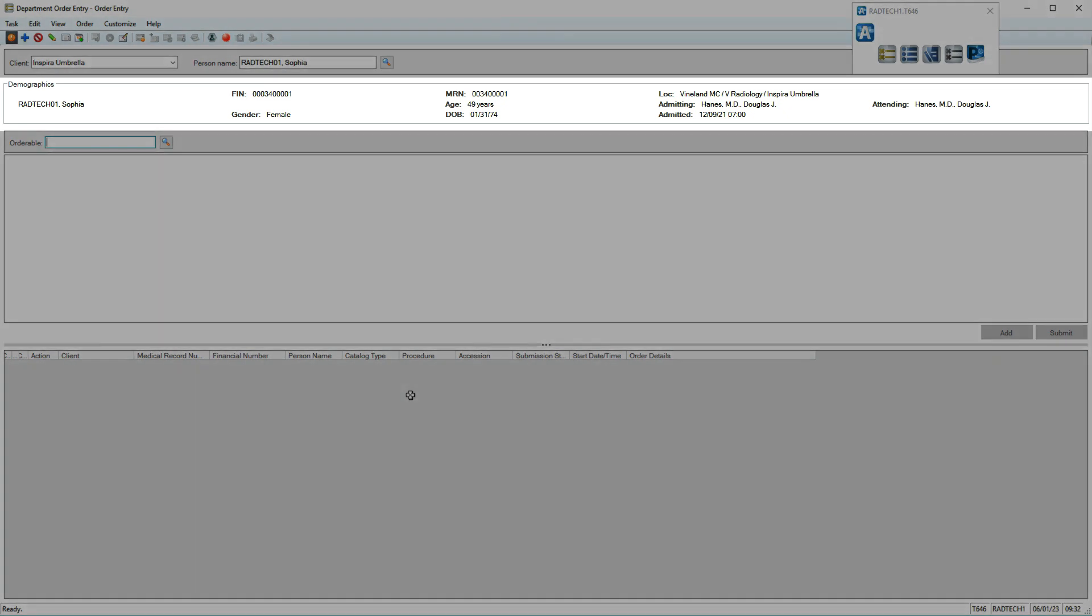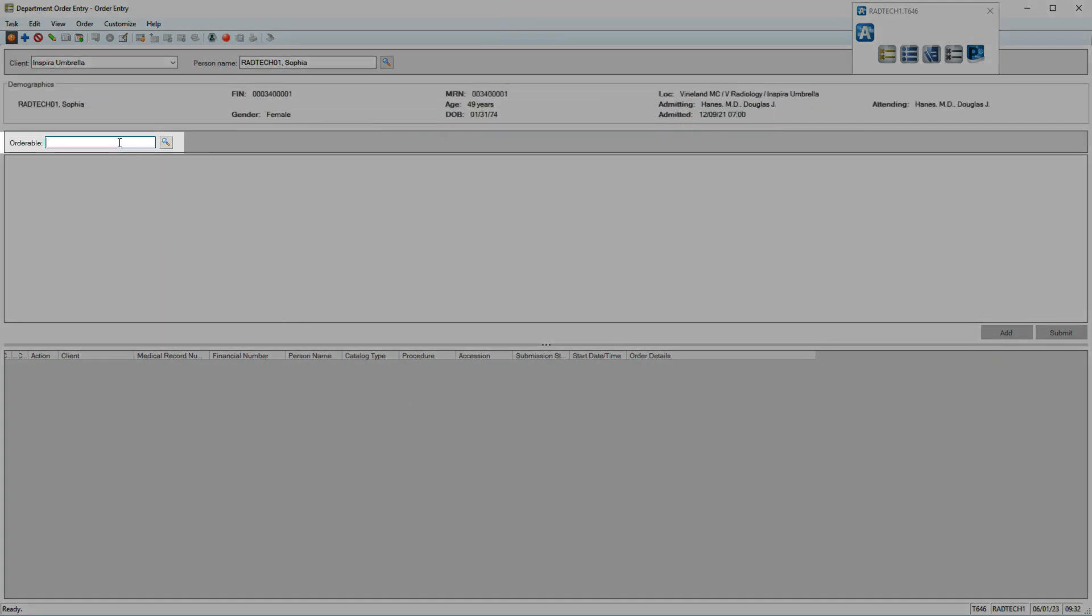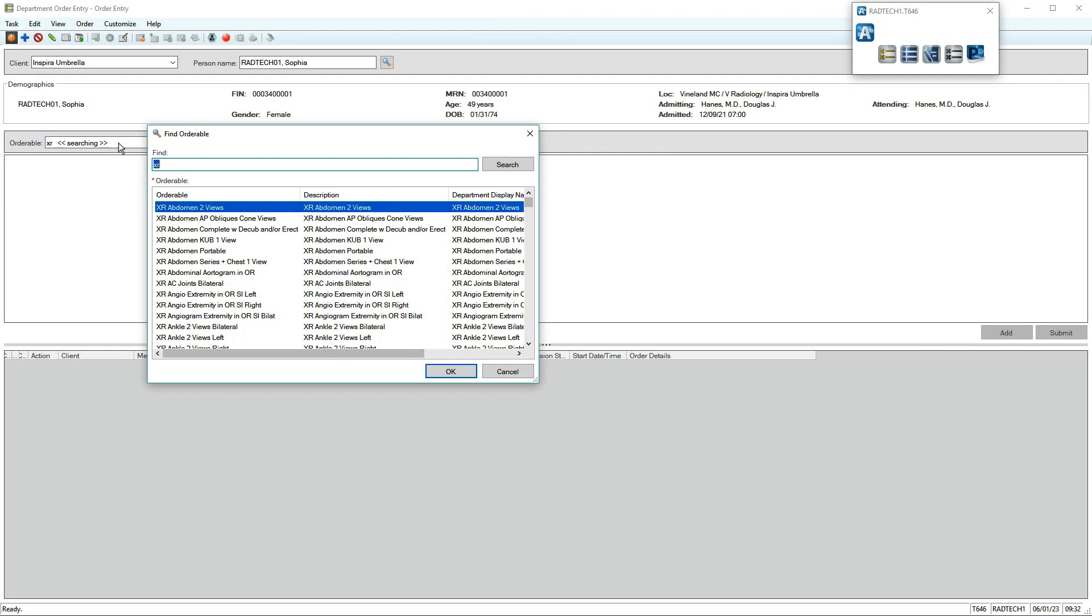Your patient's demographics and encounter details display. In the orderable field, type a search prefix and press Enter. We've typed XR, so all x-ray orders display.